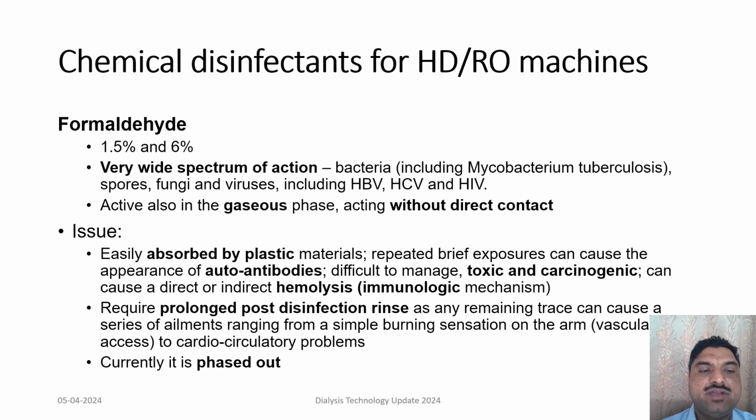One must remember that while using formaldehyde, a prolonged post-disinfection rinse is needed to remove any remaining traces, which if left inside and not properly removed, can cause various reactions in dialysis patients, from simple burning of the arms to cardiorespiratory failure. That is the reason why formaldehyde is phased out.